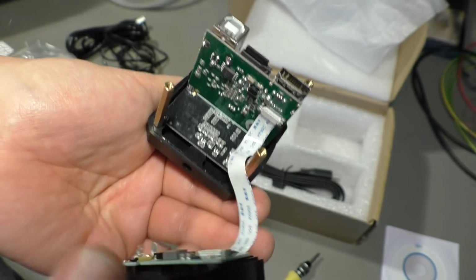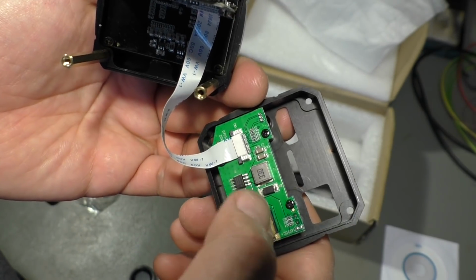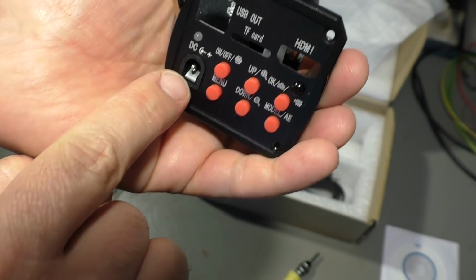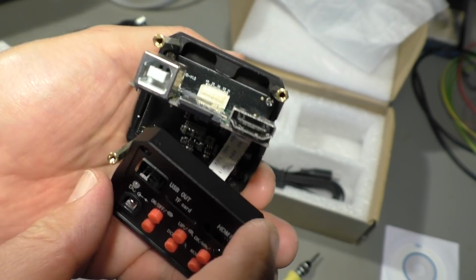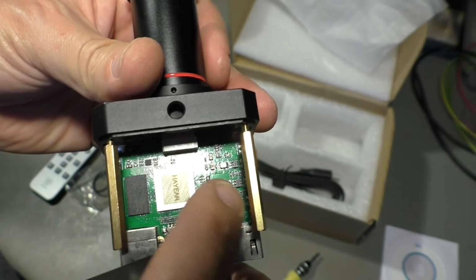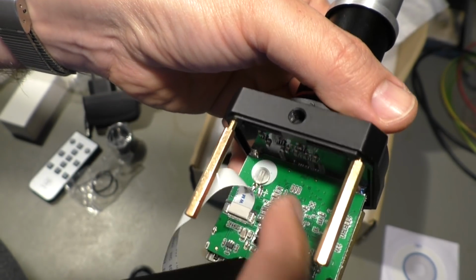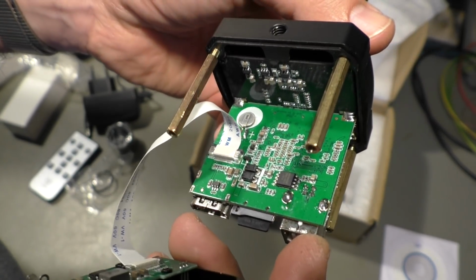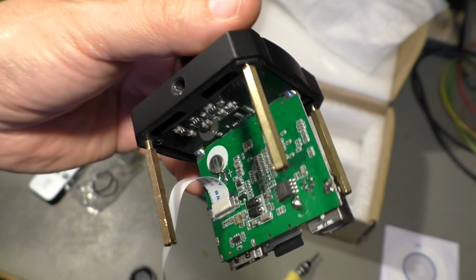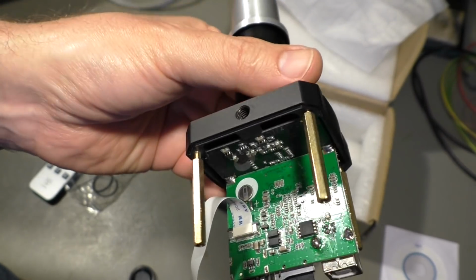Well, it's more or less the one big chip. There is, I think, a DC converter here with the coil and the diode. That's a typical DC converter. 12 volt input, 5 volt input through the USB. Yeah, that's about what it is. Some other DC converters. Okay, so there is a little battery to store the setup, all the information you set up in the menu here. Maybe it's also a super capacitor. Can't see that, there is no marking on it.